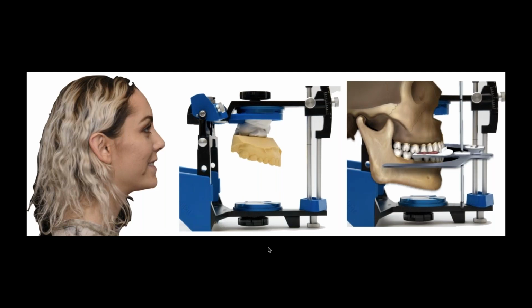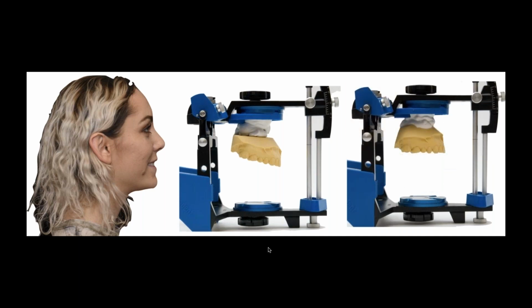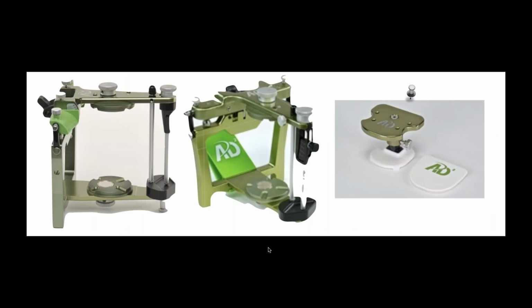I discussed this a little bit in our last occlusal lecture when I talked about the importance of understanding the transfer and the envelope. Without going into too much detail, when we use face bows or ear bows, you're changing the plane or the angulation that we're mounting the cast to. When you use facial analyzers, you get a much flatter plane, or a much more level plane, which is much better for us to accurately work on the patient. And I think I've also said before that there's a million systems today that do that, so you're not limited to one system anymore, which makes it better.